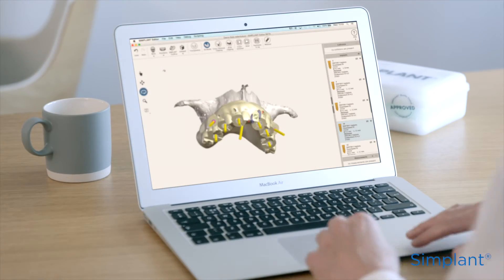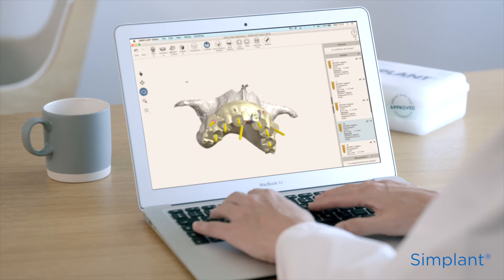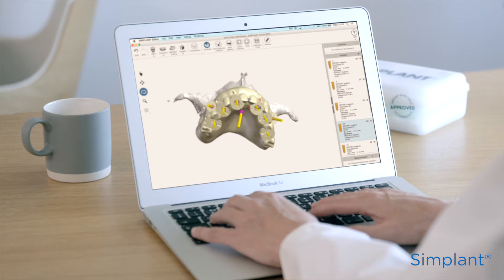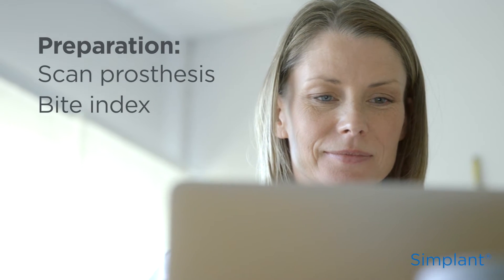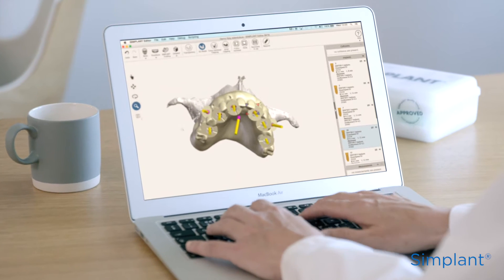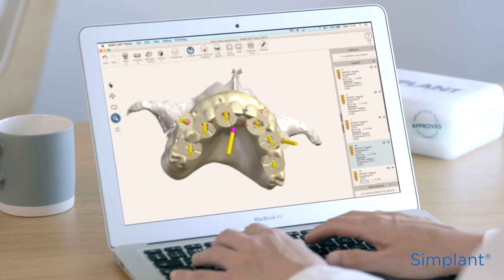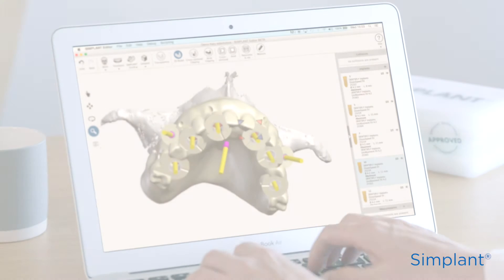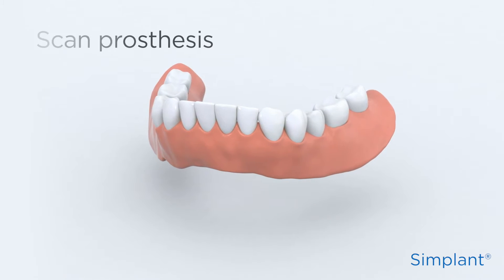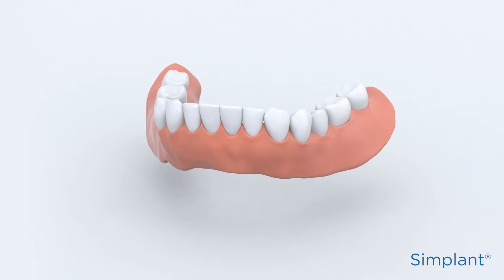When preparing and taking the scan for the planning of an implant case, the key to success is the accuracy of the information you collect. To scan a fully edentulous case, you'll need to prepare a scan prosthesis and bite index — make sure they're both radiolucent. The scan prosthesis is used to visualise the prosthetic end goal and to design the implant guide.